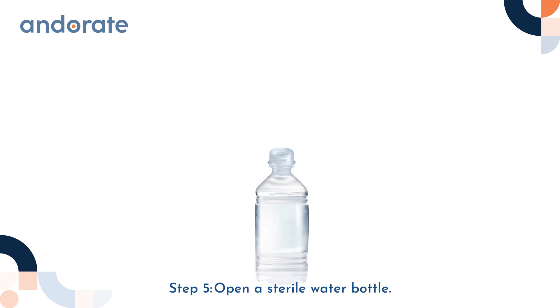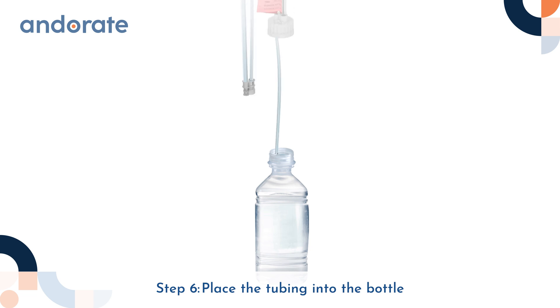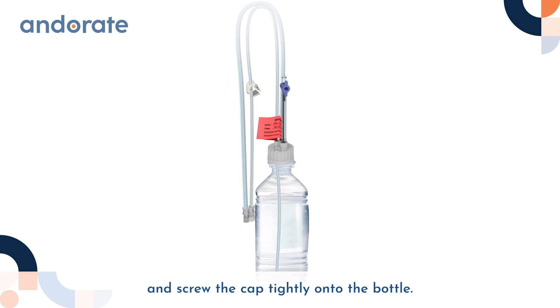Step 5: Open a sterile water bottle. Step 6: Place the tubing into the bottle and screw the cap tightly onto the bottle.